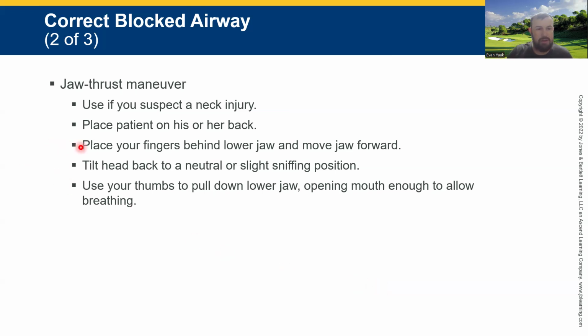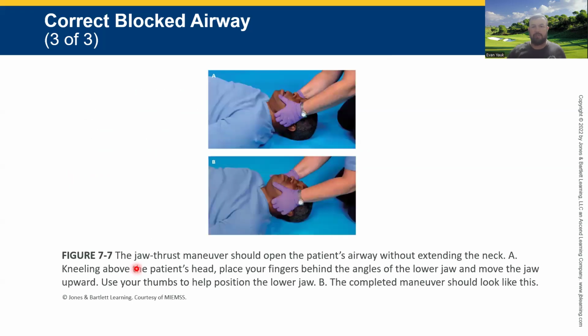I disagree with this right here, tilt the head back in a neutral. This procedure is designed not to move the head. It's designed not to have movement in the neck or spine area, so we are not actually tilting the head. I don't agree with that portion right there. We will practice this in class. Okay, cool.